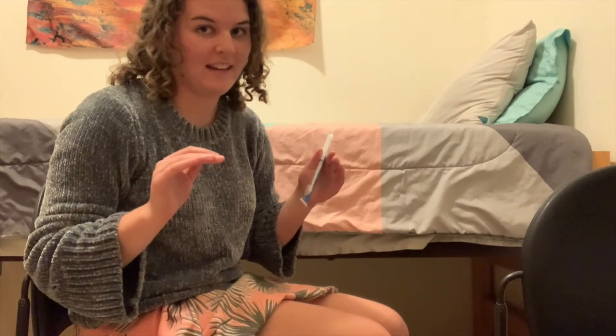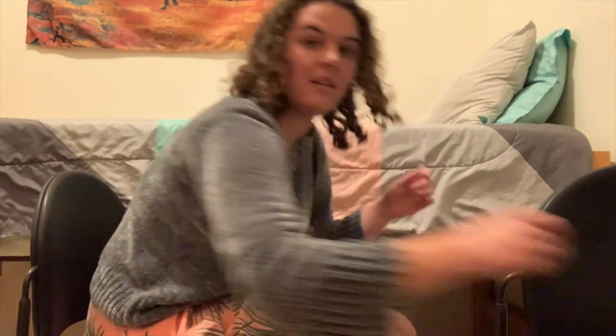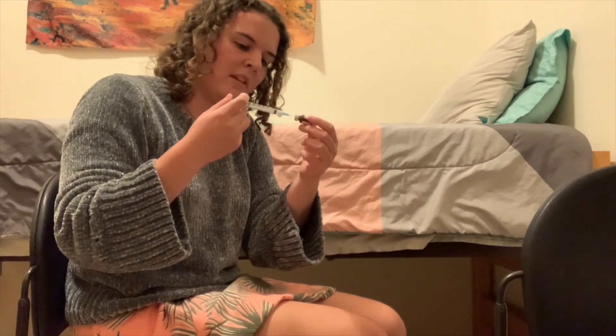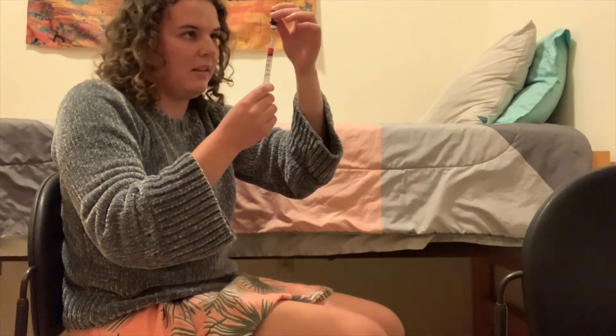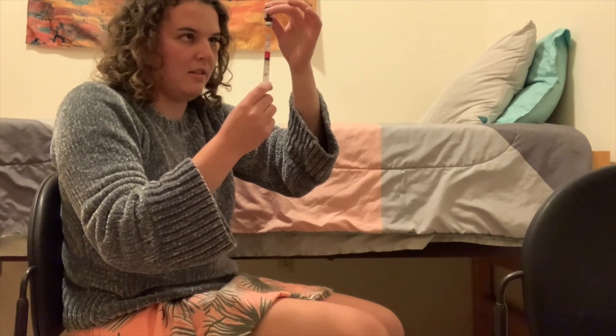Now that you have everything sterilized, we're ready to get going with the injection. Open up your needle — it has a cap on it. Take your vial. Once you take the cap off the needle, make sure it doesn't touch anything to keep everything sterile. Take the cap off and draw up one milliliter of air on the syringe. Then carefully take the needle and put it into the vial through the little rubber part on the top, and inject the air into the vial. Then flip it upside down and draw out all of the solution. There should be one milliliter in your vial, so once you get to one milliliter on your syringe, you know you've got it all. You can also look through the vial to see how much you have, and just keep pulling back on the syringe until you have all of your solution drawn up.